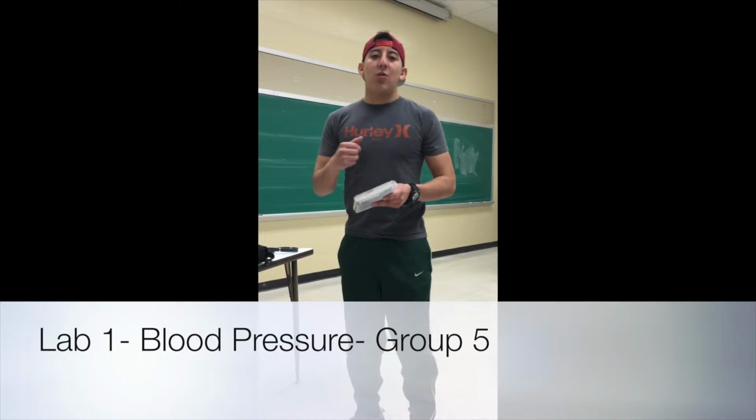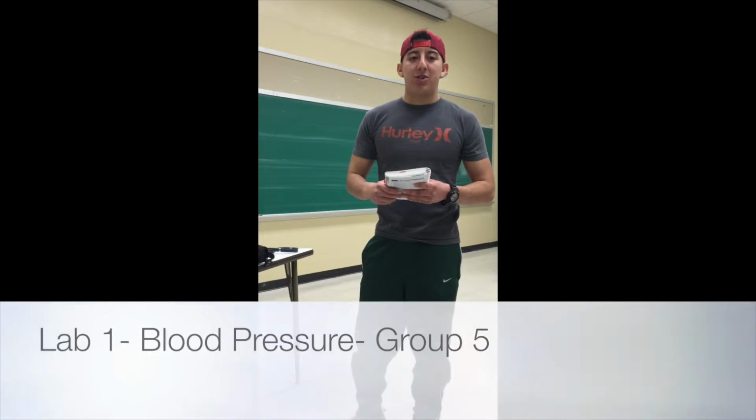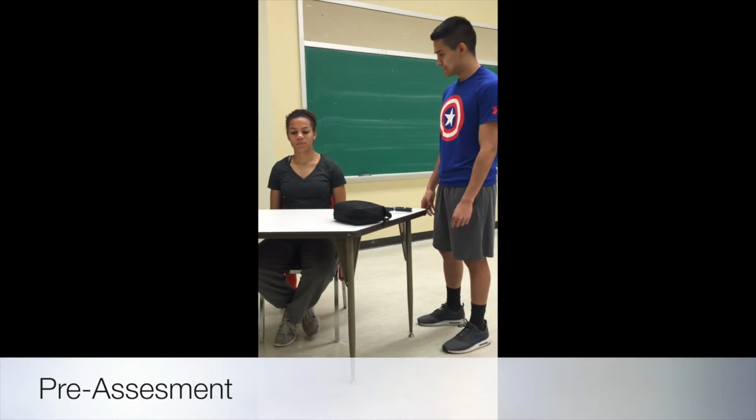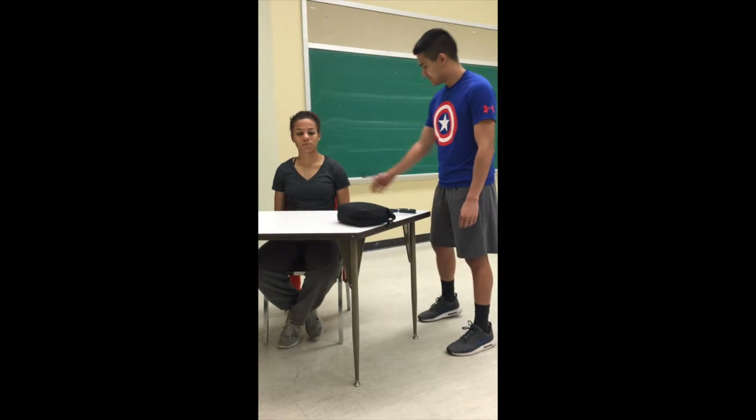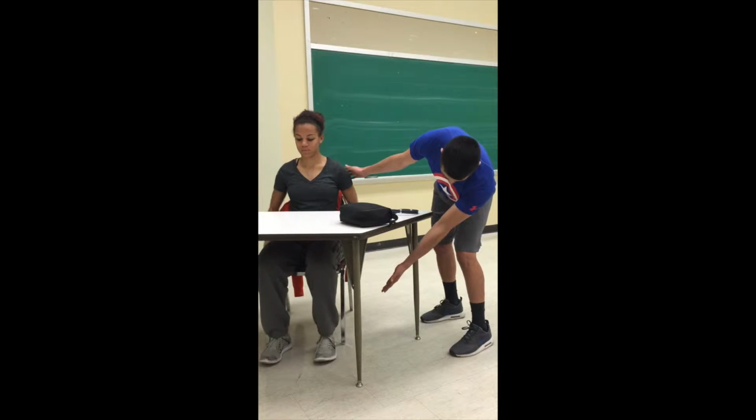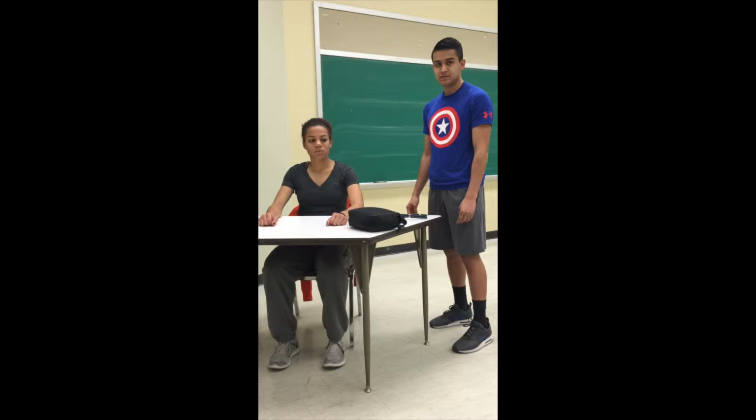Hey, we're group 5. We're going to be going over how to properly assess blood pressure today. Make sure your patient has been seated quietly for the last 5 minutes, with their back supported, their feet on the floor, and their arms supported at heart level. The patient should have refrained from smoking cigarettes or ingesting caffeine for the last 30 minutes prior to the measurement.